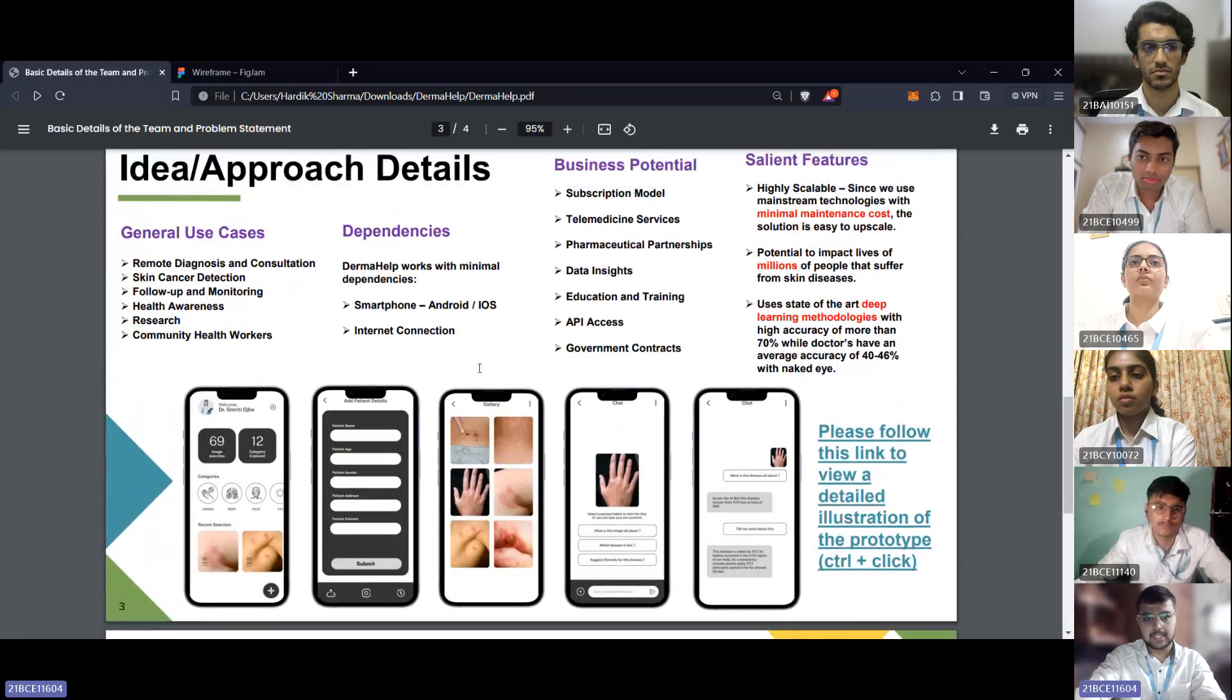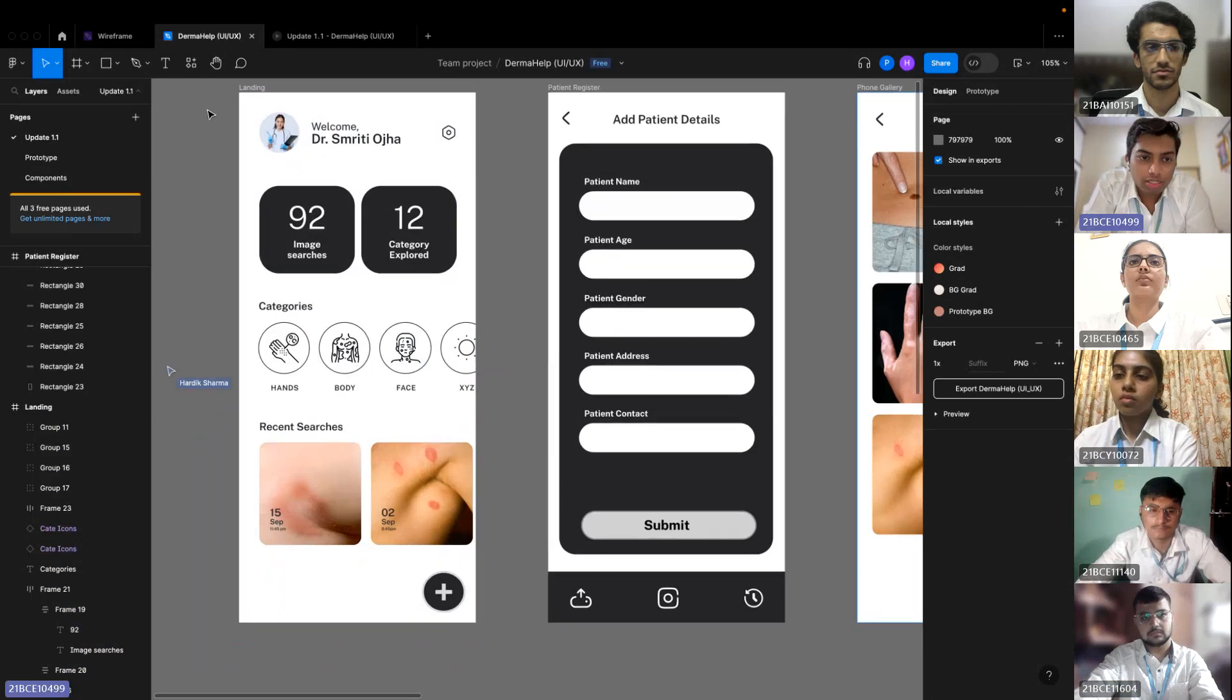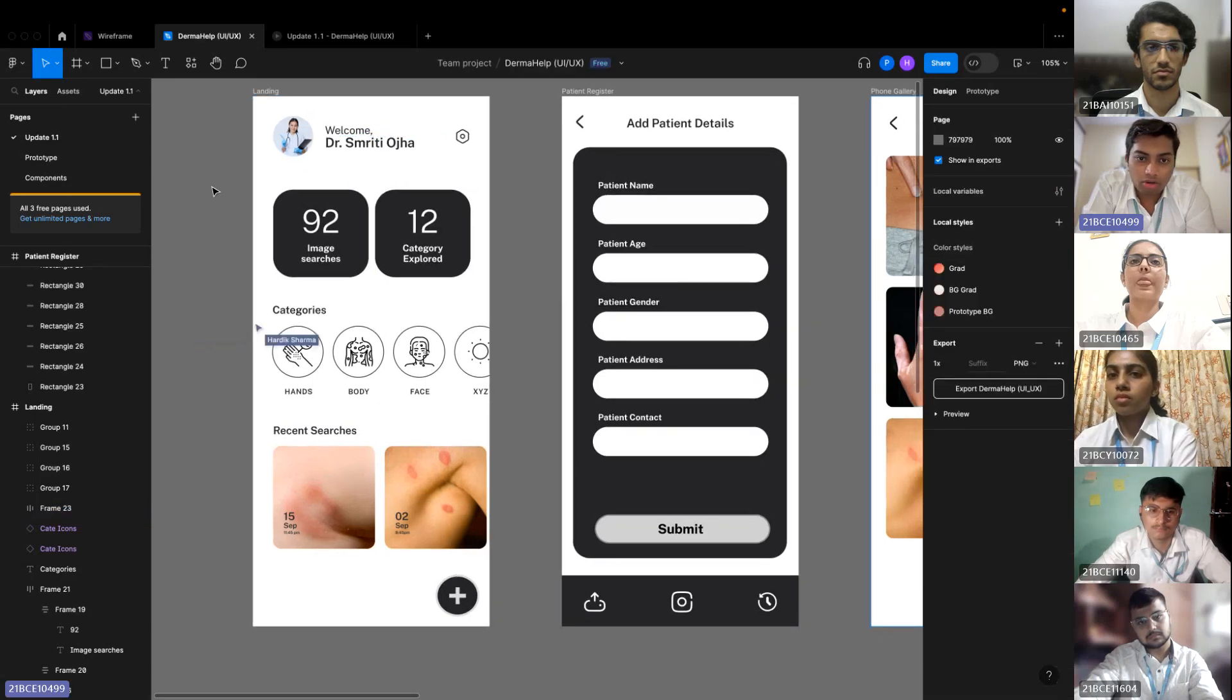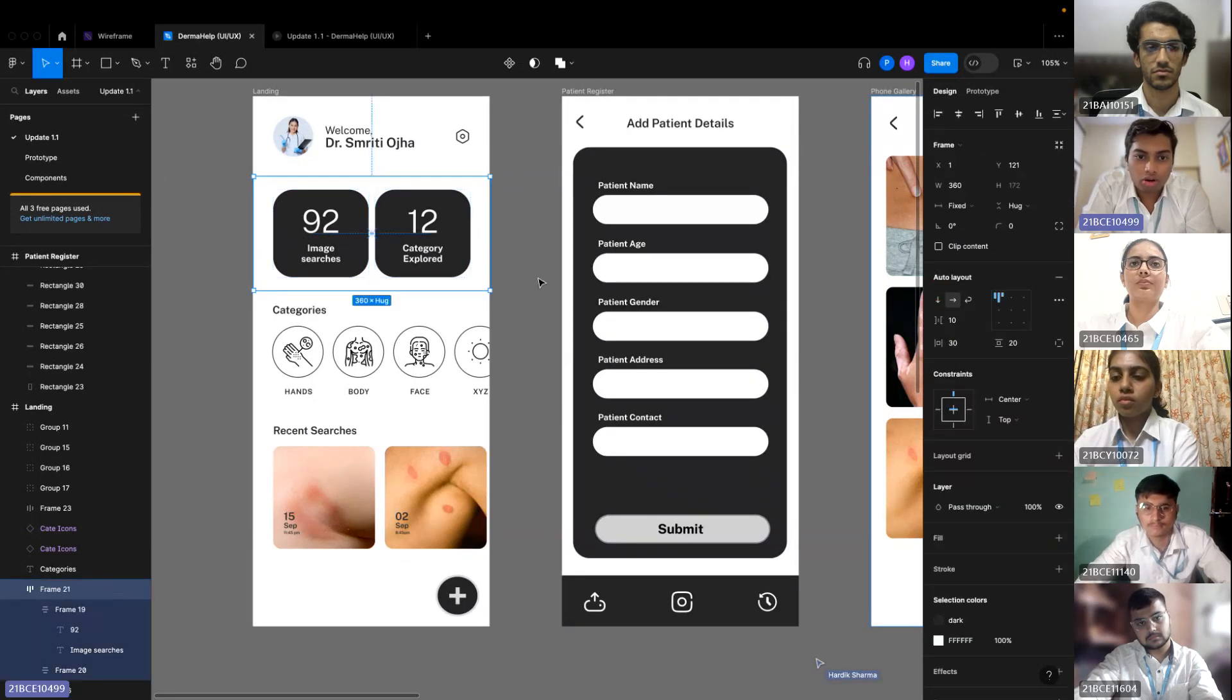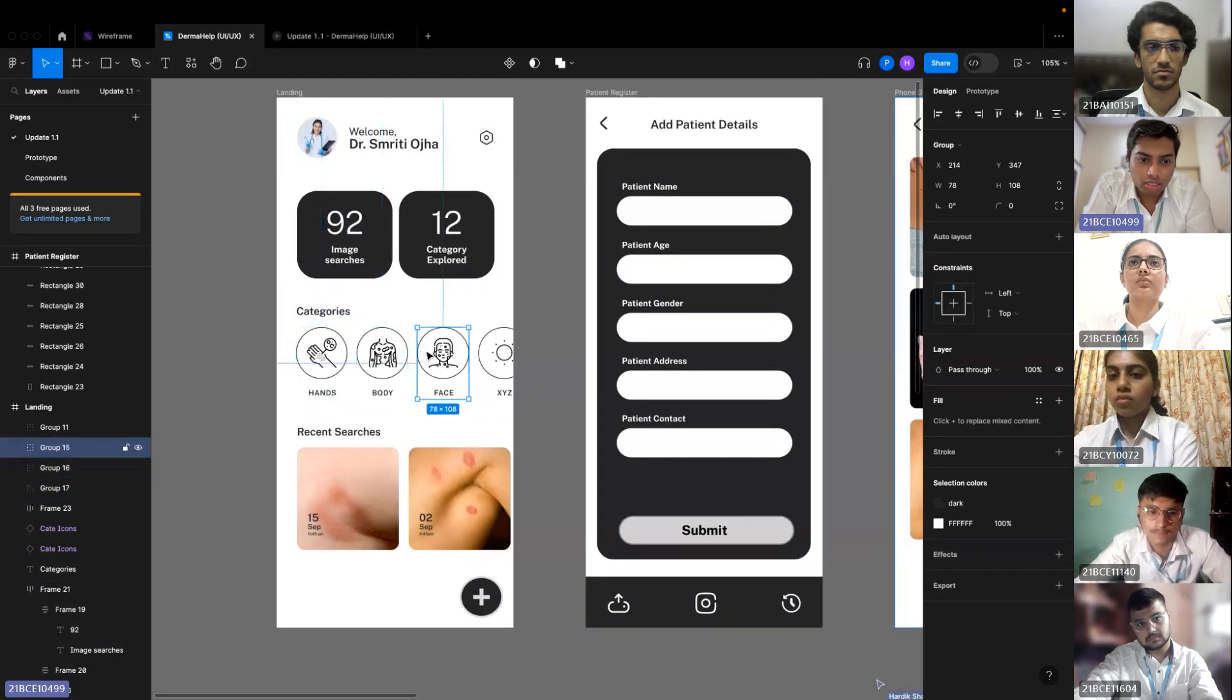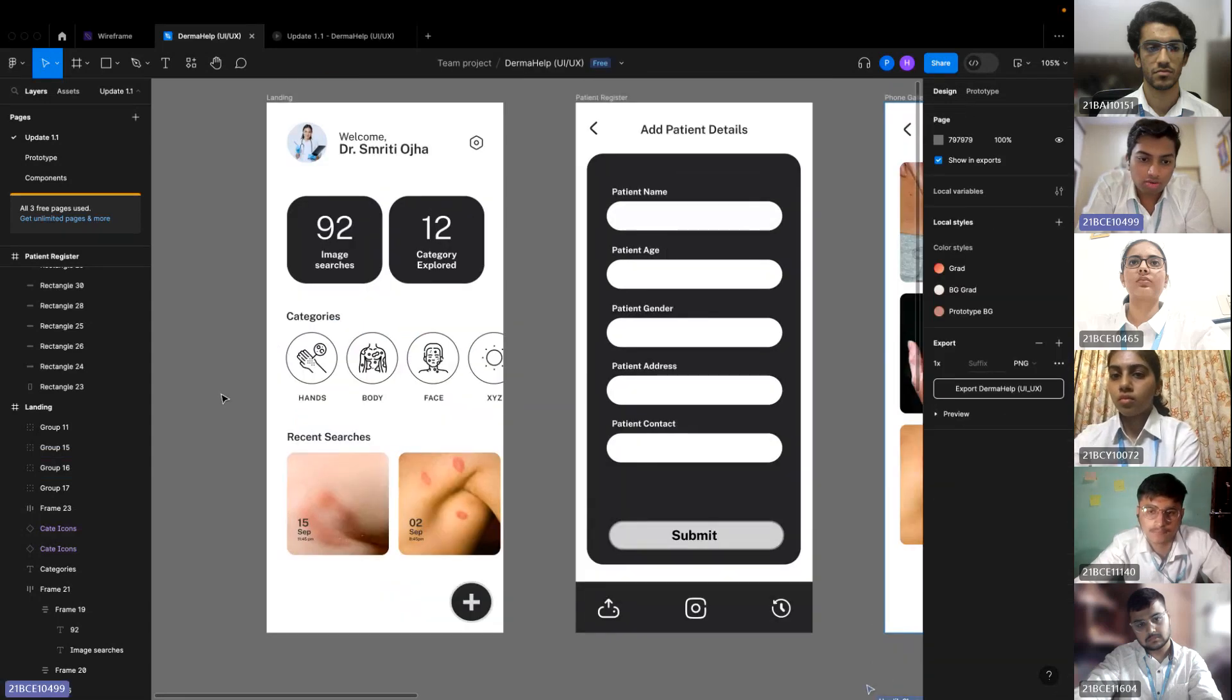Now Paras will explain the UI of this application. This is our UI of the app. As you can see, we have this dashboard. Here we can see the photo and name of doctor. There's the setting button where the user can change the light mode and dark mode. Here's the menu which shows how many images are searched and what categories are explored. Here are categories which show hands, body, face and other types of skin diseases. We can also see the recent searches.